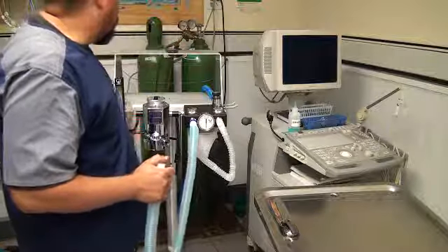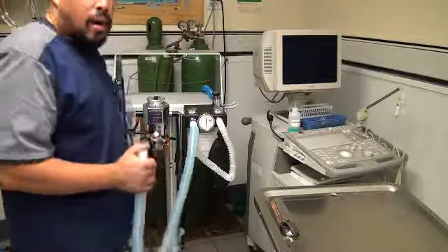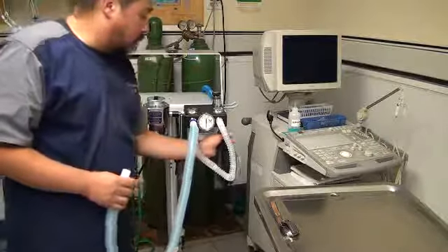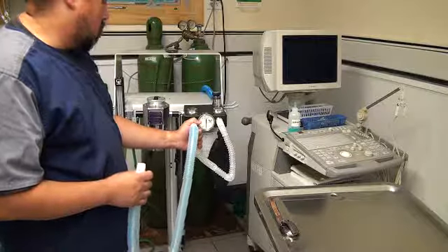The steps of performing a leak test on an anesthetic machine. We've already turned on our oxygen source and placed a reservoir bag on the machine and hooked up our tubing.